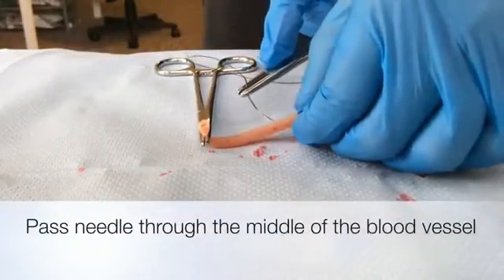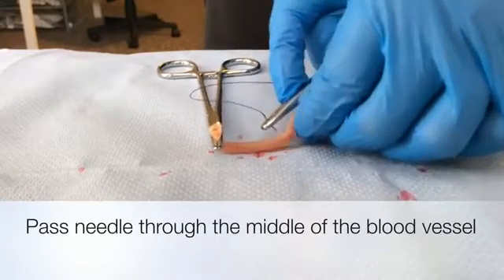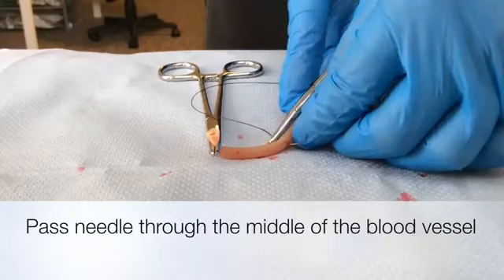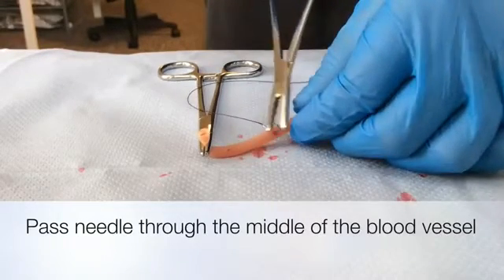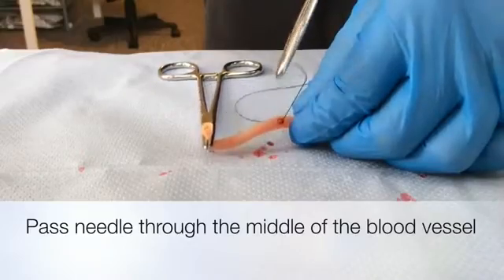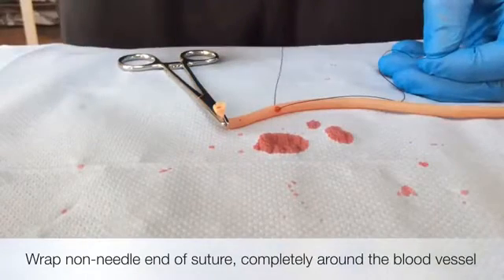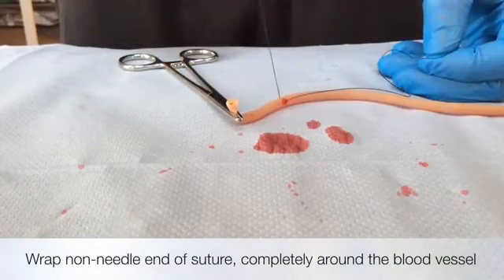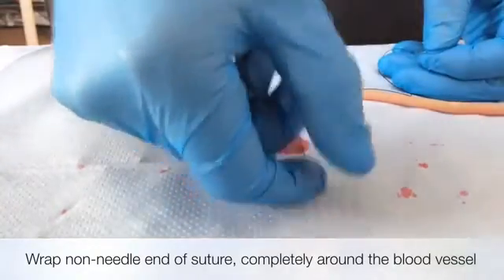Acquire some suture material with a curved needle and pass this through the middle of the blood vessel. The next step is to grasp the non-needle end of the suture thread and wrap it once completely around the blood vessel.